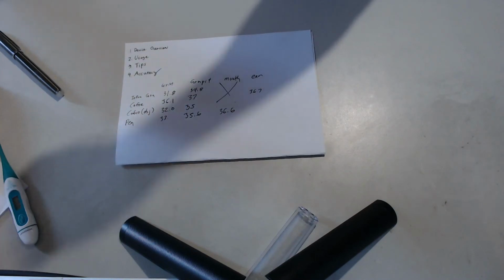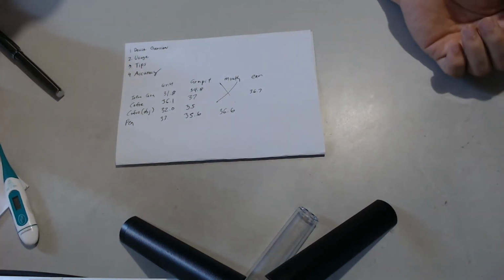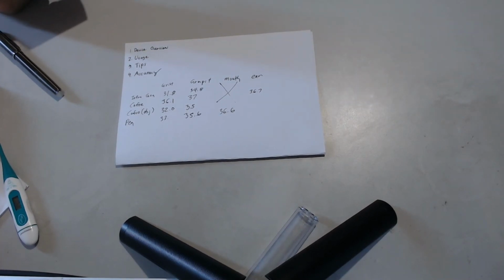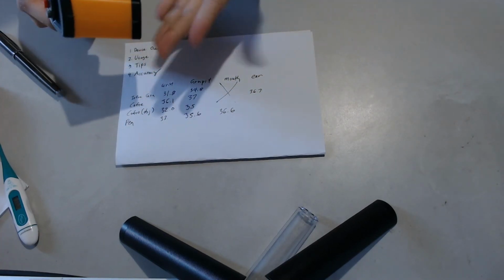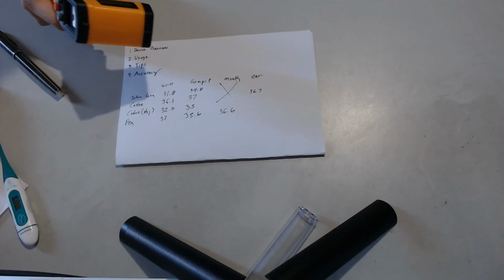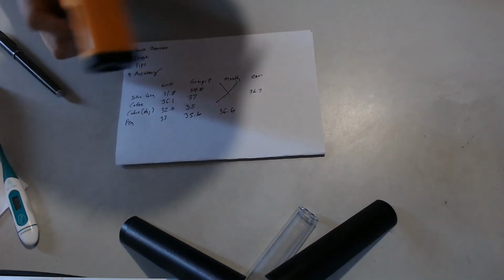So if I shove this in front of the aircon or the fan, of course it will be lower. And that's why the scanners in the mall, etc., they don't really make sense. Like, it takes a measurement of your forehead, it says 31. Hey, you're okay, but in real life, if you ask a doctor, if your temperature is 31, you're probably dying. That's already hypothermia, maybe.